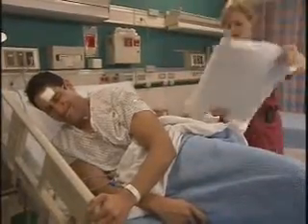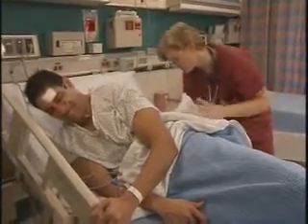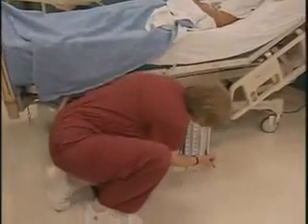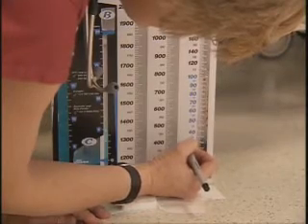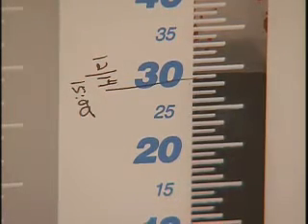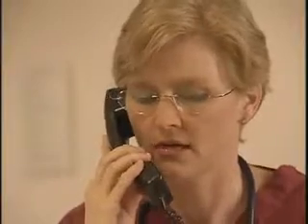To facilitate chest drainage, reposition your patient at least every 2 hours and maintain a high Fowler's or semi-Fowler's position if tolerated. Check the character and volume of the chest drainage once every hour or more often. Near the drainage chamber, mark the date, time, and fluid level according to hospital policy. Notify the physician if chest drainage exceeds 100 milliliters per hour. Excessive drainage can signal hemorrhage, which may require surgery.